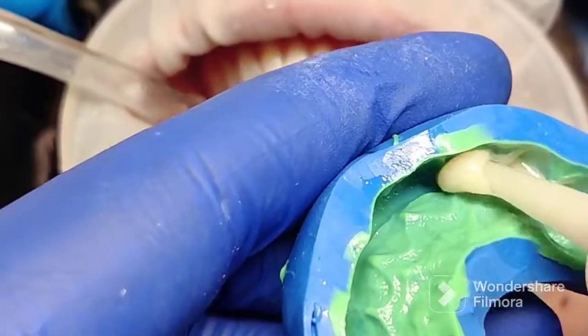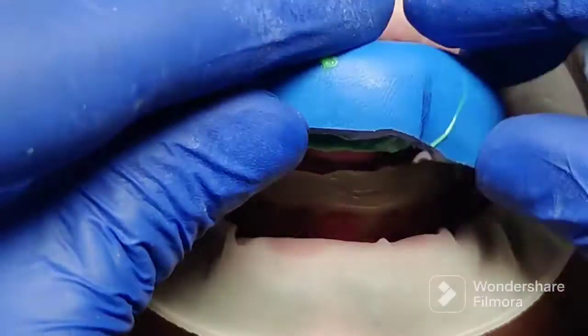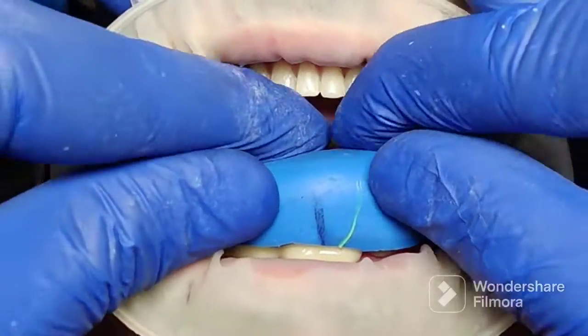Once that is done, you are now going to load the bisacryl temporary self-cure resin material into the putty index, and you're going to squirt some on the teeth as well. It's important to maintain isolation throughout this entire procedure.